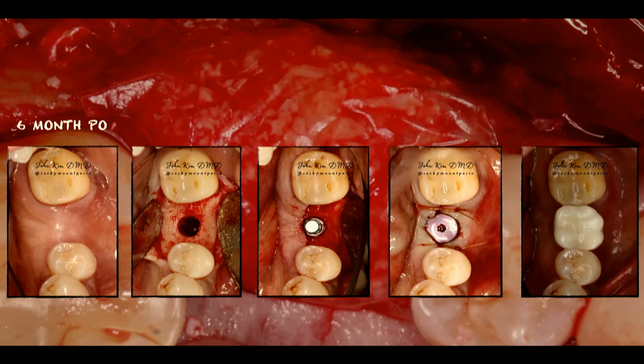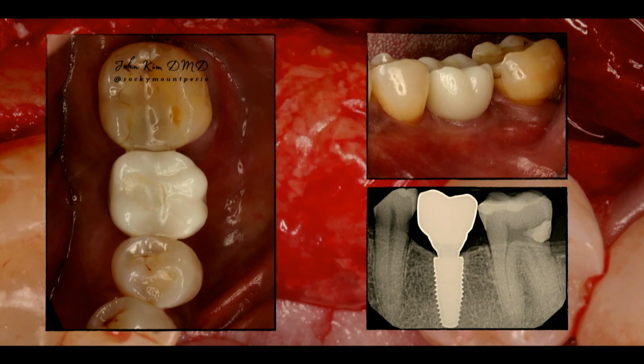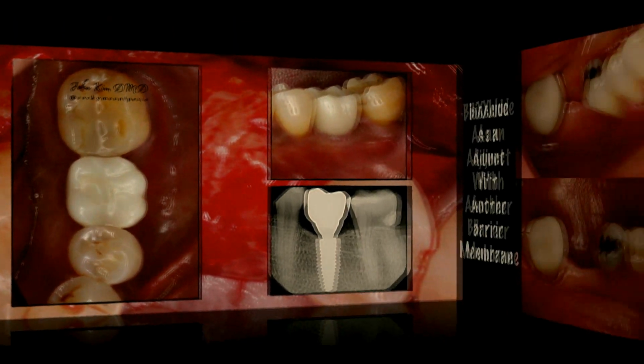The shade of that crown is a hair off. I don't know if BioXclude had anything to do with that. But what I really like with this is that, I can't remember if this is 1 or 2 years out, I can't remember, but just a cortication. I mean, got some good bone in there from a ridge augmentation procedure.